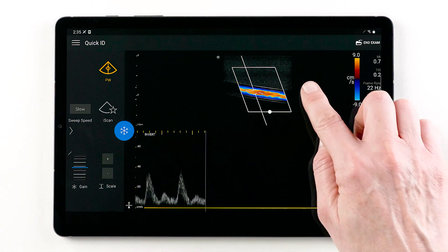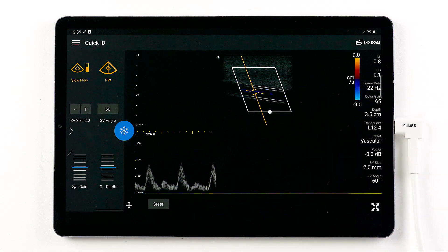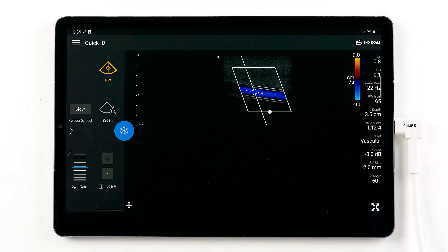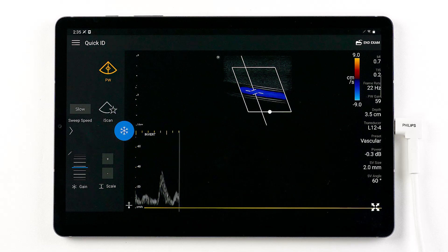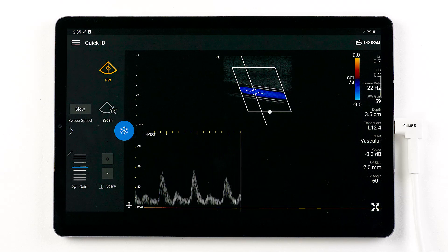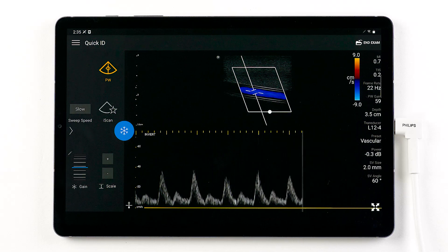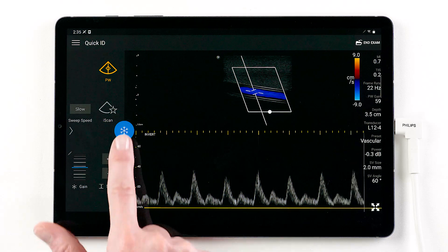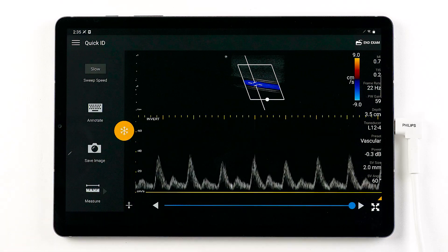Invert the Doppler waveform. Tap the 2D reference image to update. Tap the blue snowflake to freeze your image. From the frozen state, you can continue to make adjustments to the pulse wave display.